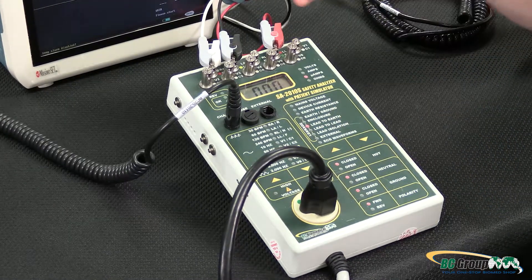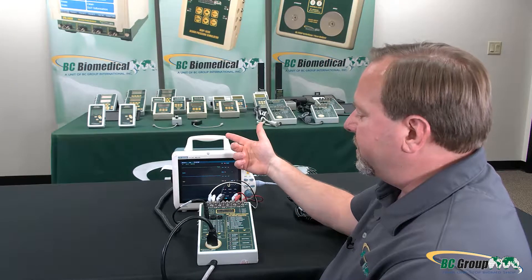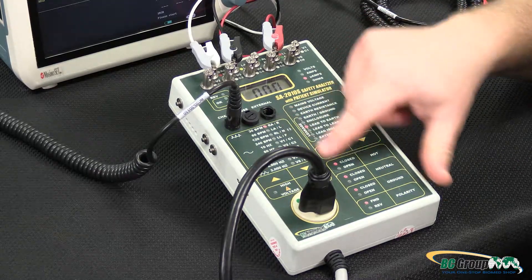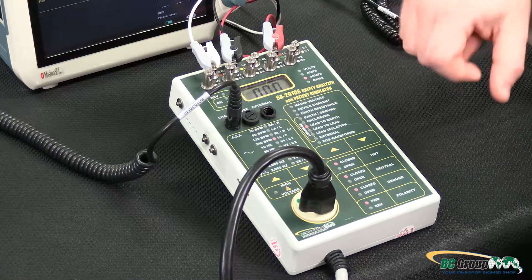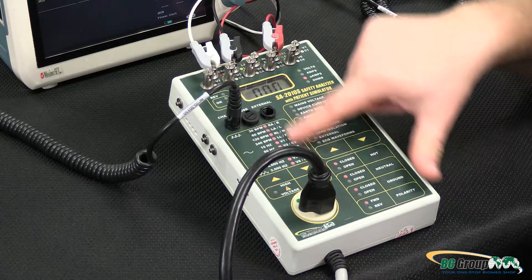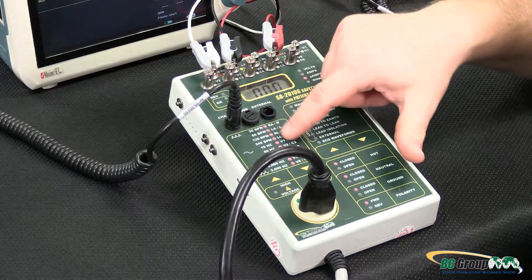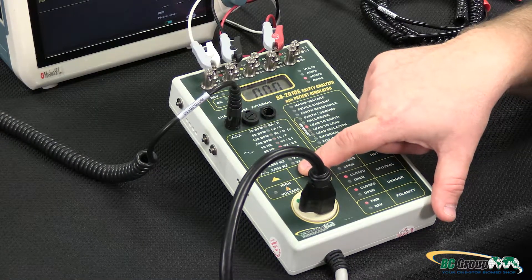Lead to earth will measure any patient leads that could be connected to a person, to earth ground — making sure that if those leads touch me or if I'm laying on a grounded table, I'm not going to get shocked. We need to select which lead we want to test, and we can test each lead one at a time. In this case we measure zero microamps on each lead. We can also measure all of them at the same time for a quick check. If all connected leads give a passing test, we don't have to test each one individually; but if we fail with all of them connected, we can go back and select one at a time to determine which one is causing the problem.